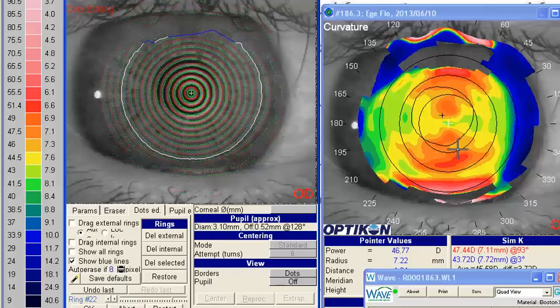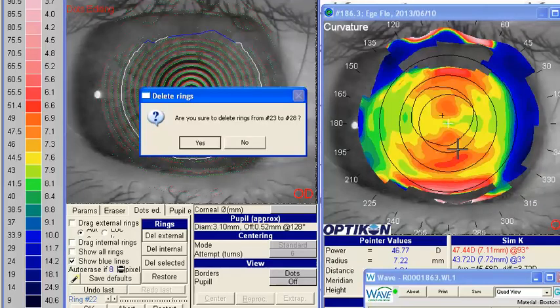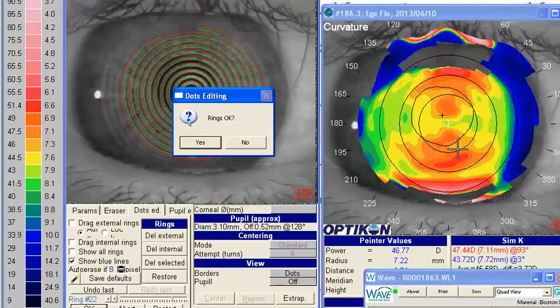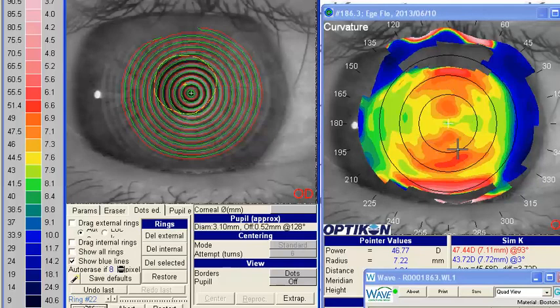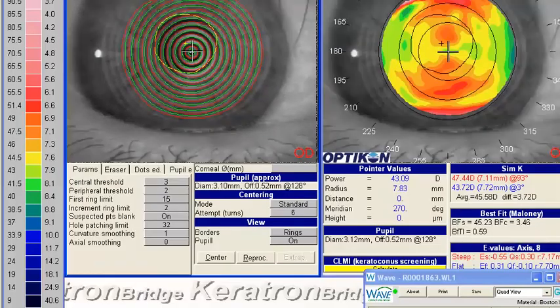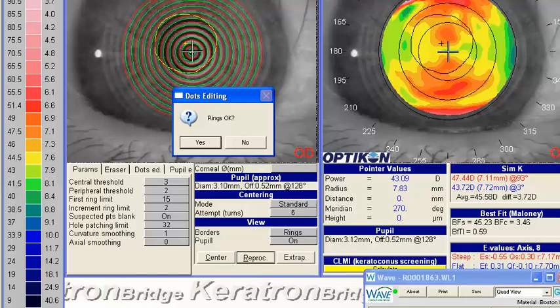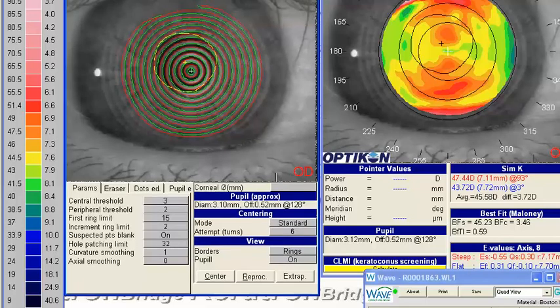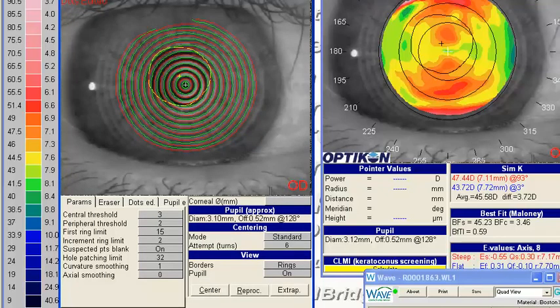And then I'm going to say on that one, I'll sync a couple points.